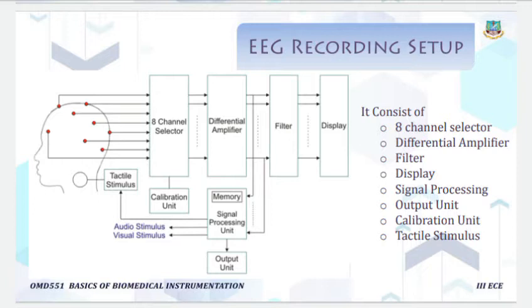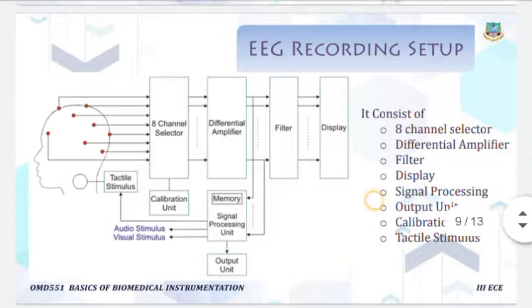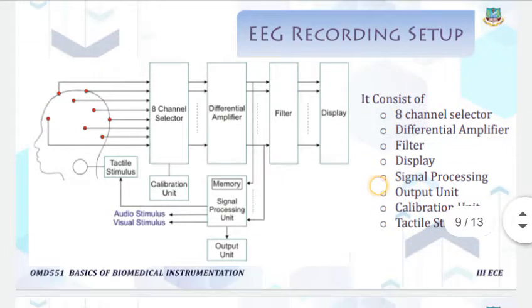It is mainly used to reduce noise. There may be 50 hertz interference present in this signal, created due to AC interference, and it is reduced by the differential amplifier, which acts as a preamplifier with 80 decibel common mode rejection ratio, and it also uses a 50 hertz notch filter.